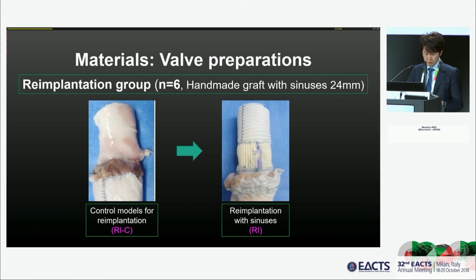Control models were prepared for the reimplantation group as well. Then reimplantation was performed using handmade graft with sinuses with the diameter of 24 mm.